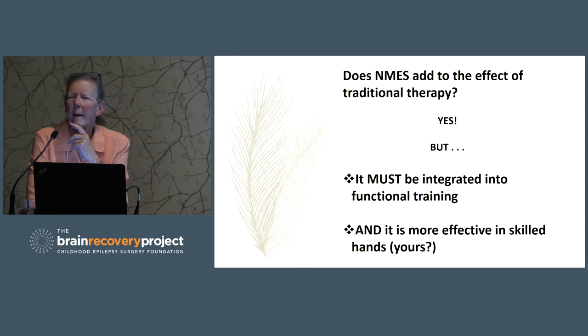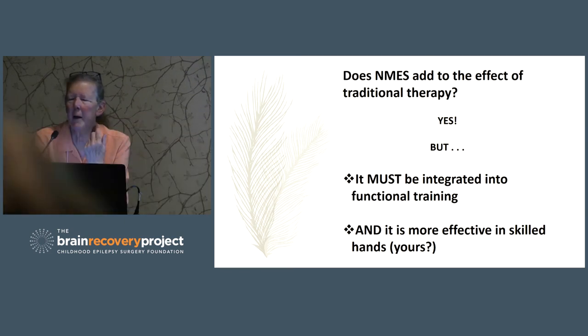I'm wondering if you have experience or if you've come across MindMove, the 8-channel upper extremity. The MyoMove? Yeah, MyoMove. Same thing. I find when I first started doing electrical stimulation, I had 3 channels of stimulation and I worked well with it, but most of the therapists on the floor with me were not tolerating it very well. So most of our commercial devices have come down to 2 channels, and that's something that a therapist manages reasonably well. When you start doing 4, 5, 6, 8 channels, that becomes an engineering feat.